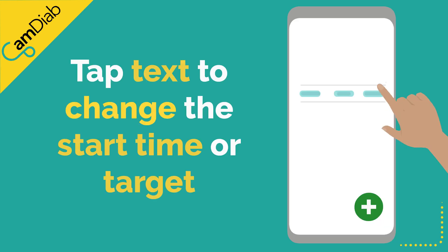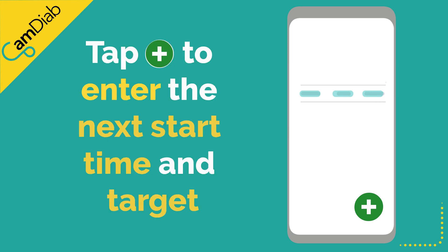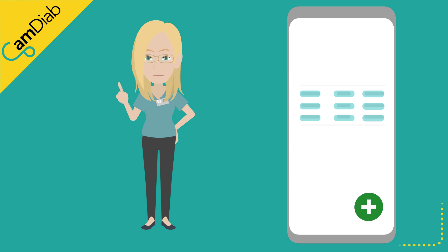You can tap on the blue text if necessary to change the desired start time or glucose target value. If more than one personal glucose target needs to be programmed across the 24 hours, please tap on the green plus to enter the next start time and target value. No end time needs to be programmed — the last time block will automatically run until midnight.